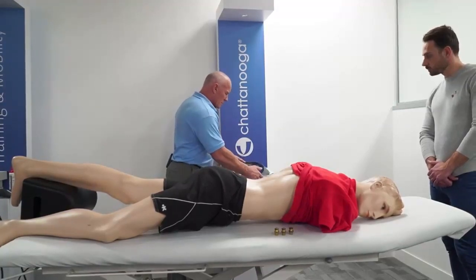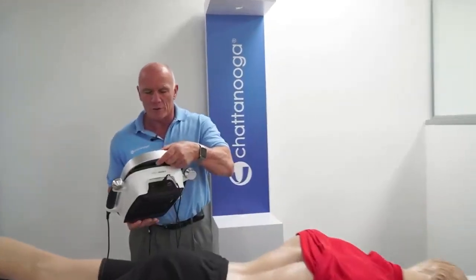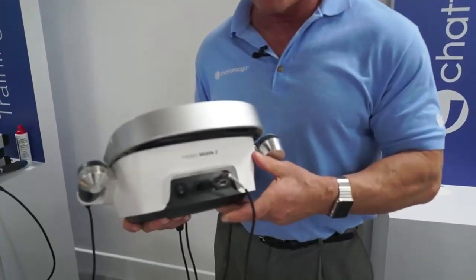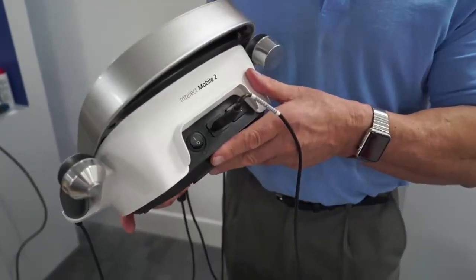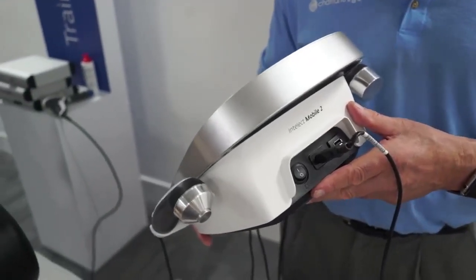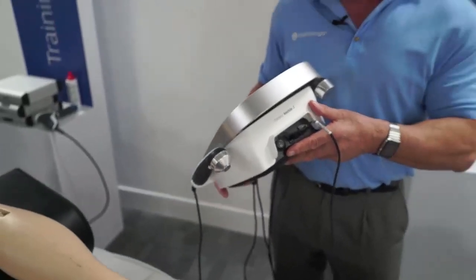The portability is important because there are more and more options now to use home care treatments rather than patients coming into hospitals. The therapists are going out into the community and treating them in their homes.